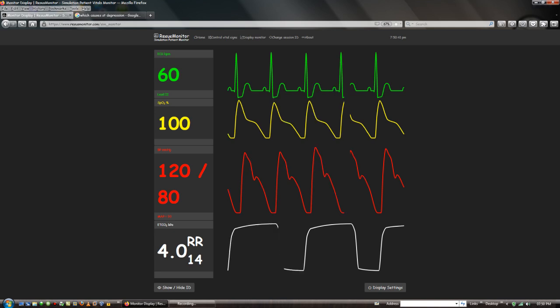Why do I keep losing the meaning? ST depression is caused by hypokalemia and myocardial ischemic heart disease, which even causes ST elevation. Now, this rhythm should be treated as quickly as possible if the patient is seen in this rhythm. Now, this rhythm is the most critical factor for the heart, and this rhythm should be treated immediately by the doctor who is treating the patient.